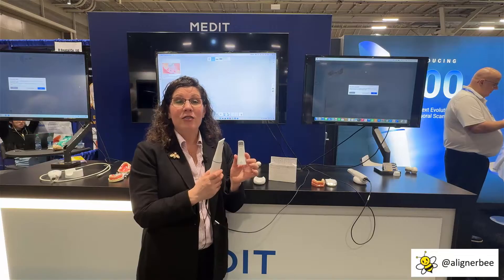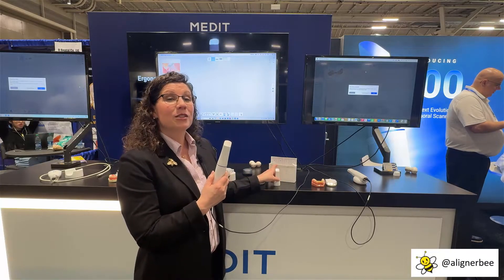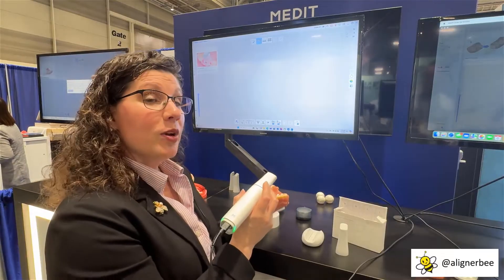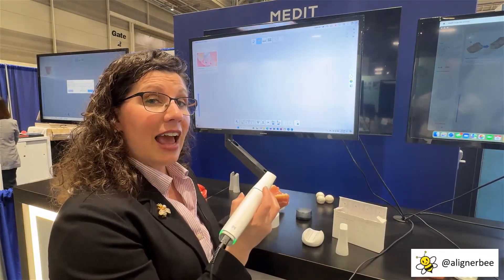With the Medit i900, it has a very smooth scanning speed, and it's very fast. Let's go ahead and take a scan. We're going to begin by double-touching the on-off band, and that's going to activate our scanner.